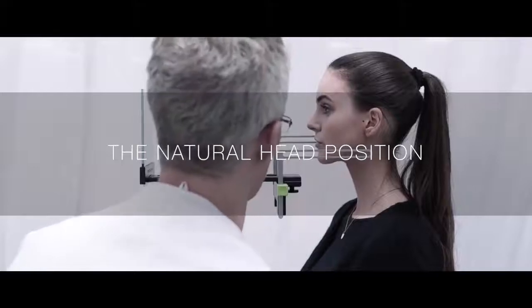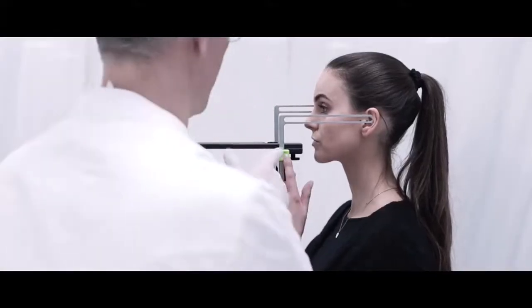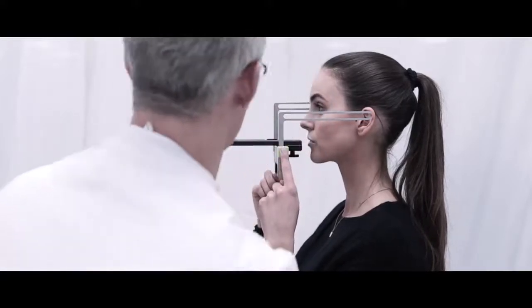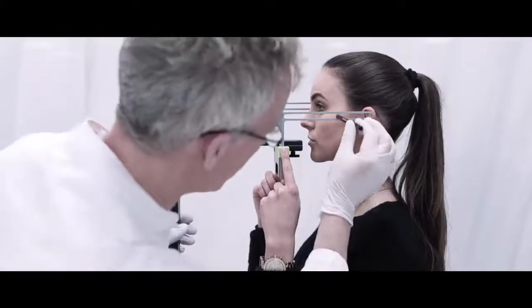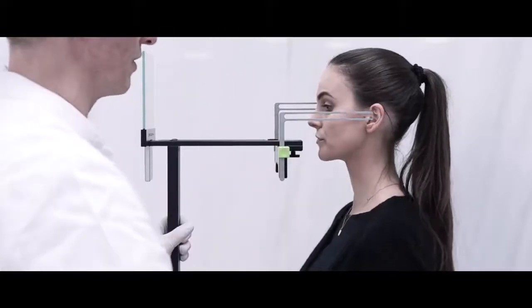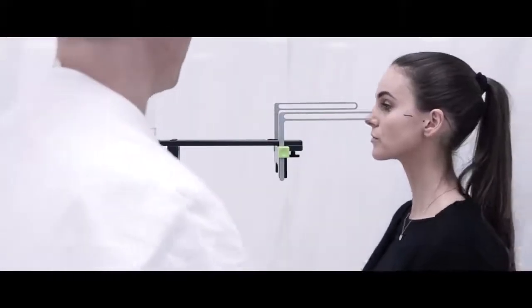After the first phase of facial scans, the dentist uses the plane finder to detect the natural head position and the natural plane. He asks the patient to stand in front of the plane finder for the final adjustments before acquiring the scans. Several recordings are made in order to verify that the natural head position is always kept. The dentist marks a guideline on the patient's face, at the level of the bar parallel to plane 0.